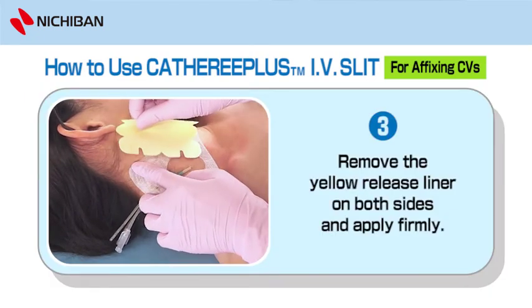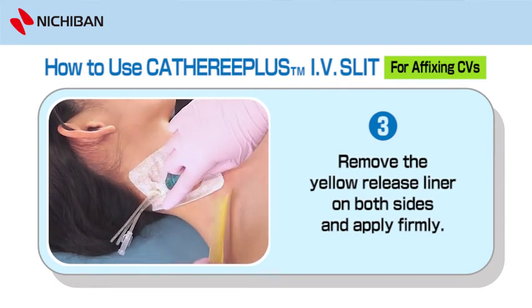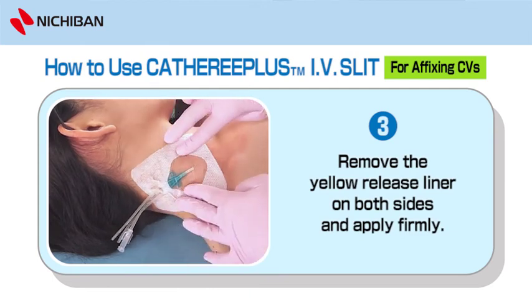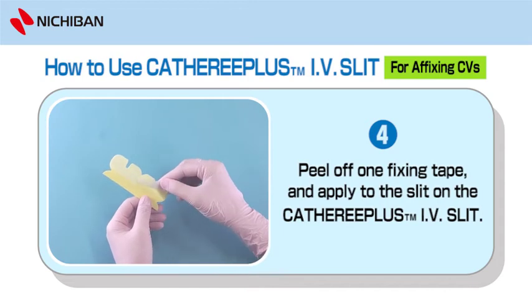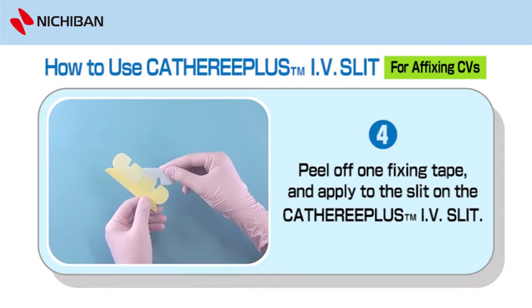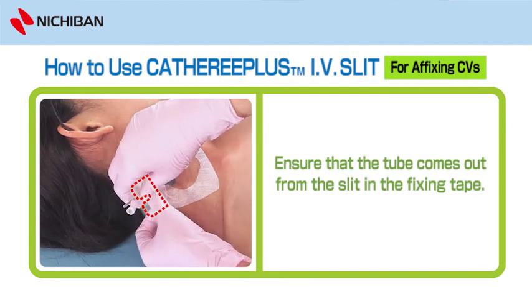Step 3: Remove the yellow release liner on both sides and apply firmly. Step 4: Remove the fixing tape and apply to the slit on the Catharee Plus IV Slit. Ensure that the tube comes out from the slit in the fixing tape.